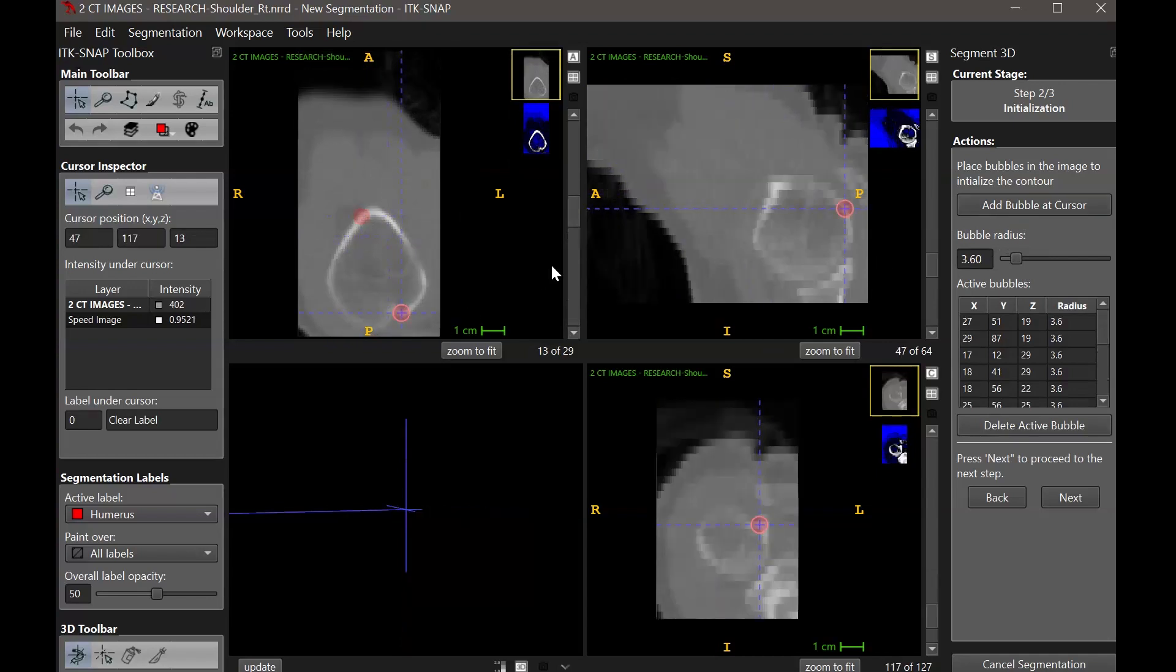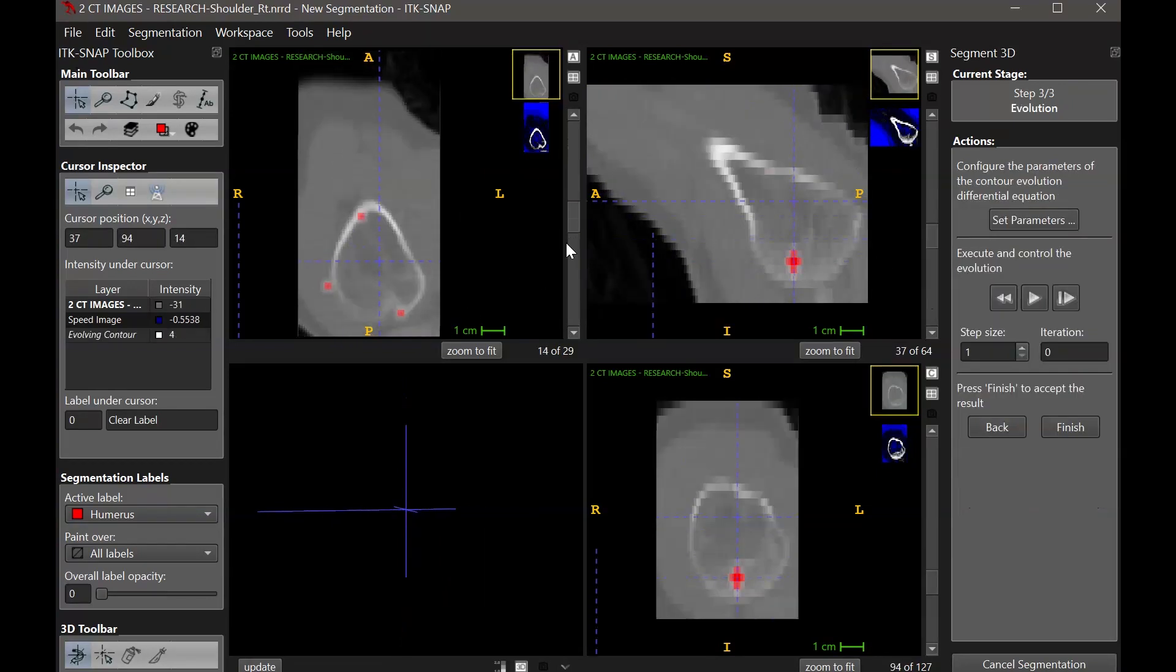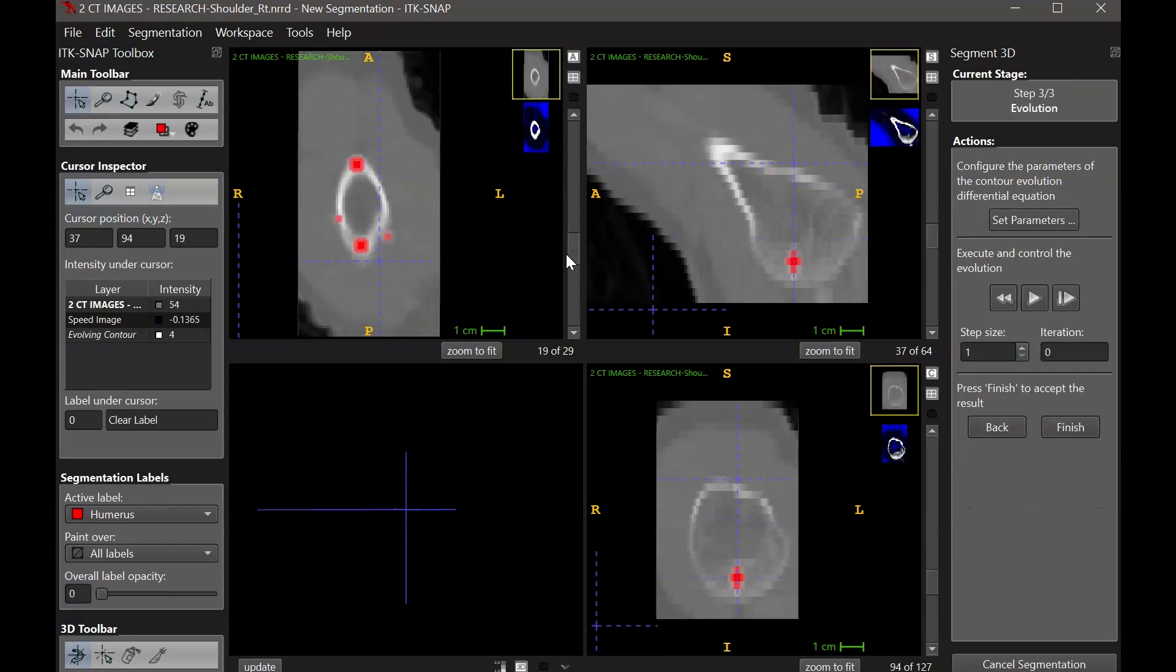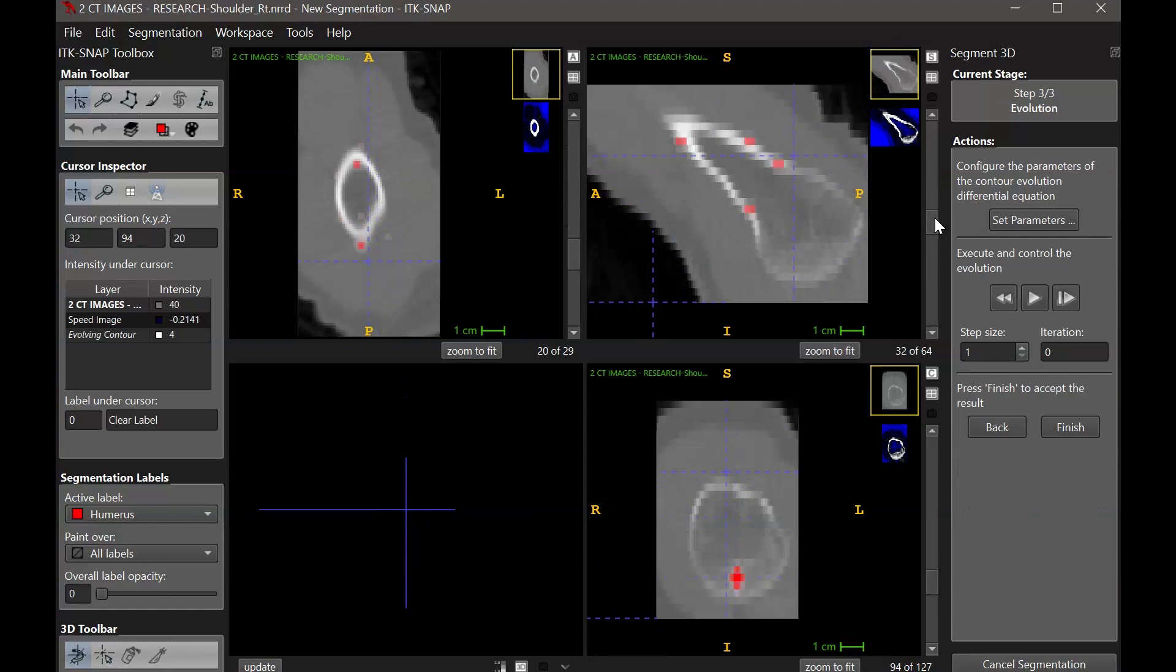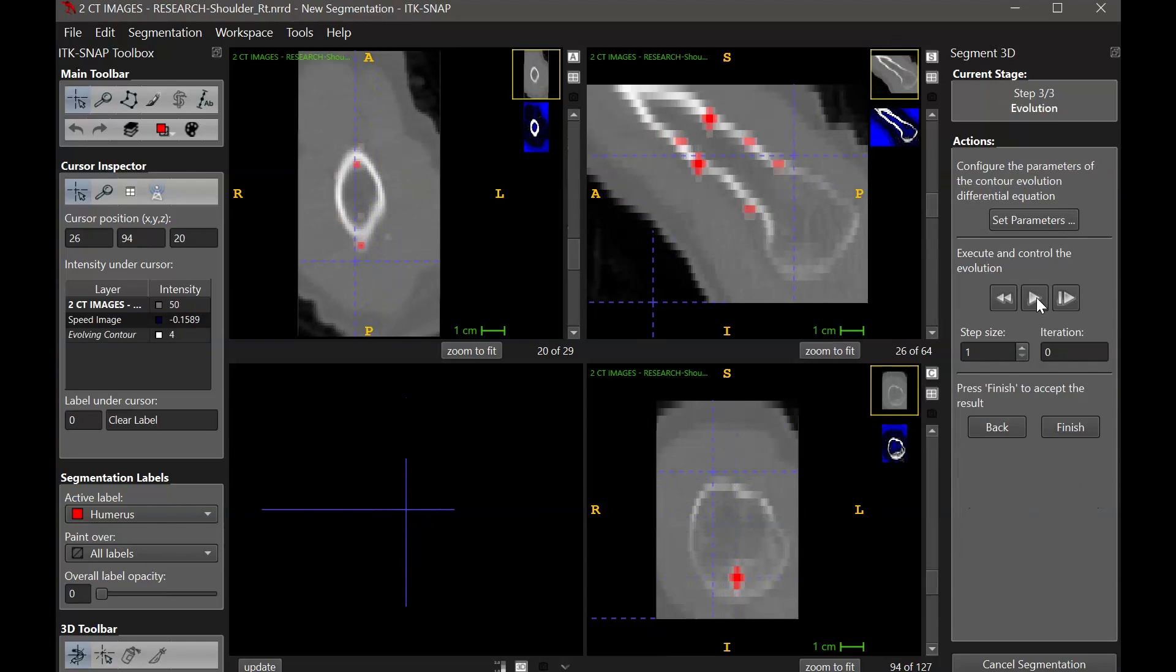To initialize with bubbles, the next step is to do the evolution step. This step uses the speed map from your threshold values and the bubbles that you initialize with. So the areas of the image with high speed, which are likely part of the segment, will be included.